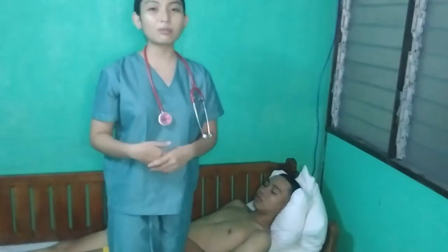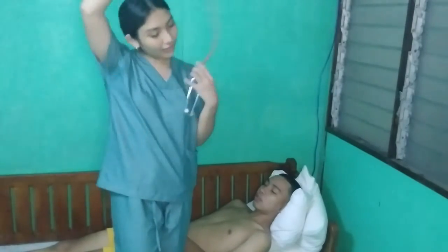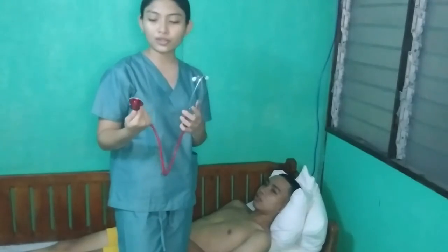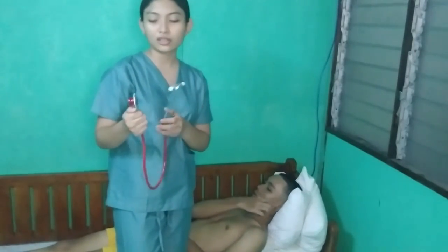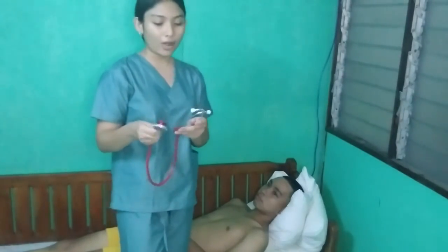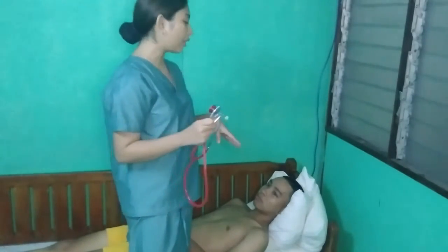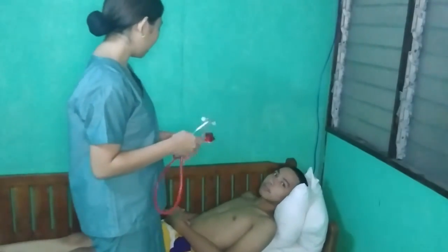Okay, so after palpation, we are now going to do auscultation. So in doing that, I am going to use a stethoscope. I'm going to use both the bell and the diaphragm, but I'm going to start with the diaphragm. Start listening with the diaphragm and then follow with the bell. Okay, so I'm going to listen in various spots, similar to the areas that I palpated.